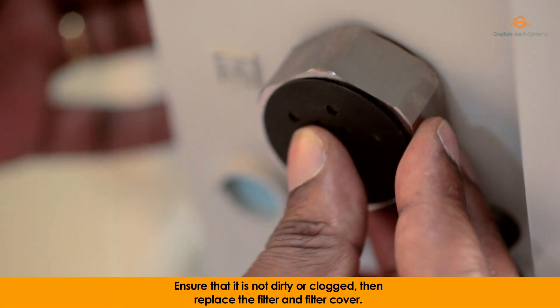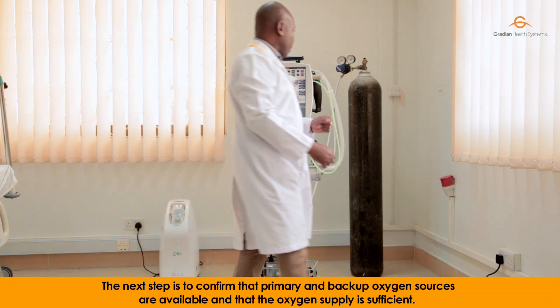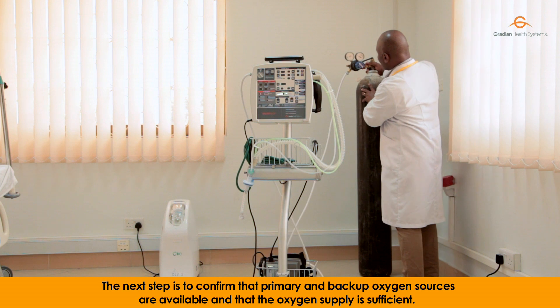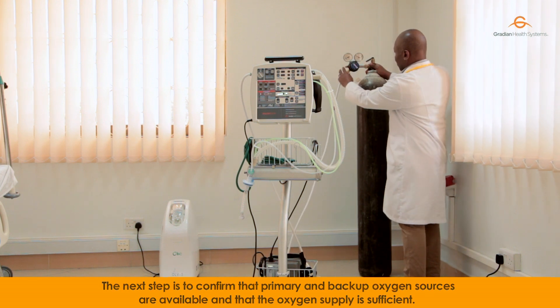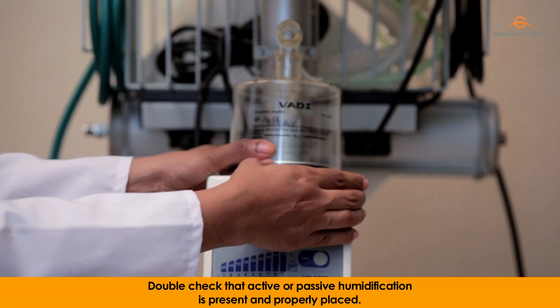The next step is to confirm that the primary and backup oxygen sources are available and that oxygen supply is sufficient. Double check that active or passive humidification is present and properly placed.